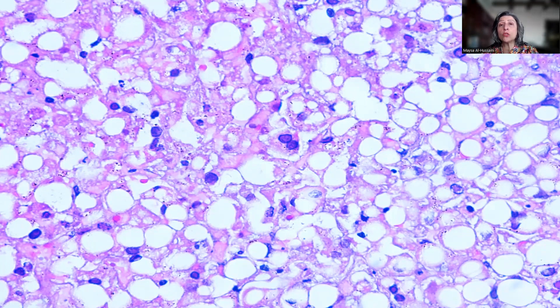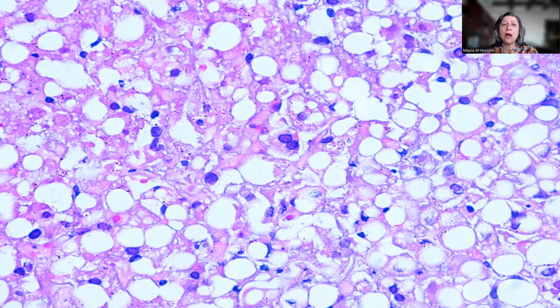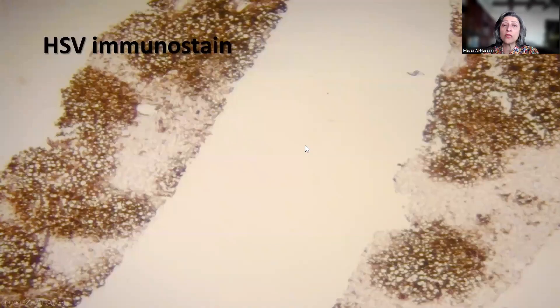These findings are really important clues to the possibility of herpes simplex viral infection. This is similar to what we see with HSV infection in the skin or in the esophagus. Rarely encountered — or perhaps rarely biopsied — in other locations like the liver, but once you see those important clues, it should bring the possibility of HSV infection into the differential diagnosis.